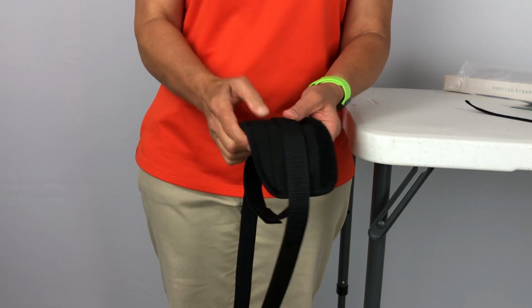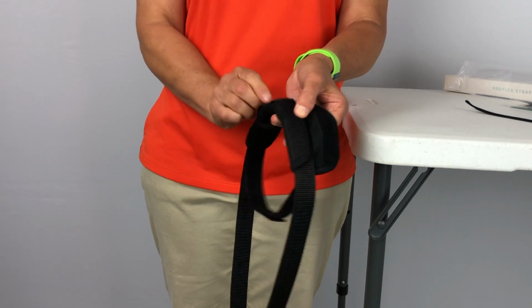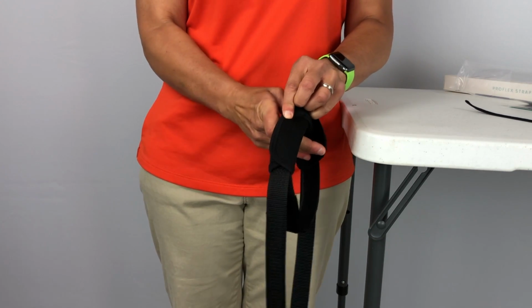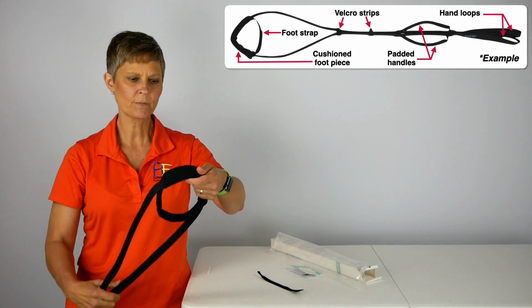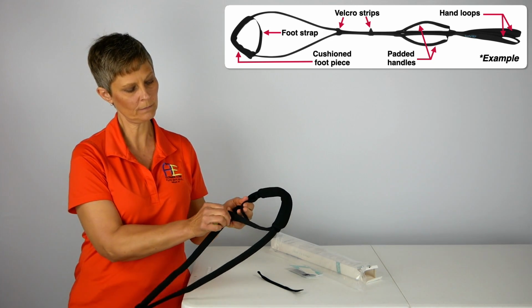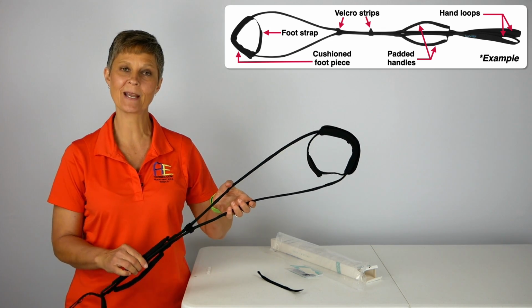And then what I'm going to do is just fold it over, just like this. I'm going to fold it over right along the PROFLex strap, right like that. And then you can take the other side and fold over as well. There we go. So now we have the foot piece on the end. We have the foot loop here. Okay, and that's how you put the PROFLex strap together.